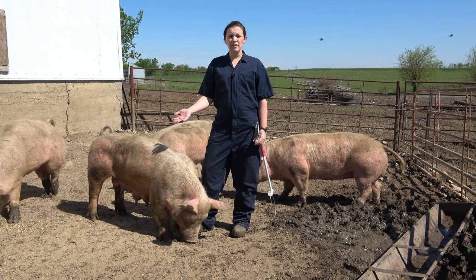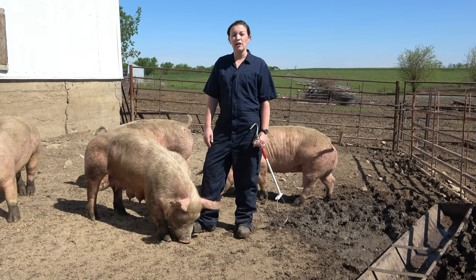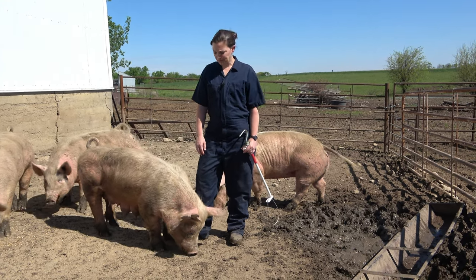On smaller piglets, it's pretty easy to do it in the axillary or the inguinal if they have some extra skin back there and you need to do a sub-Q injection. So on a piglet, those are a couple of other options that you might have as well.